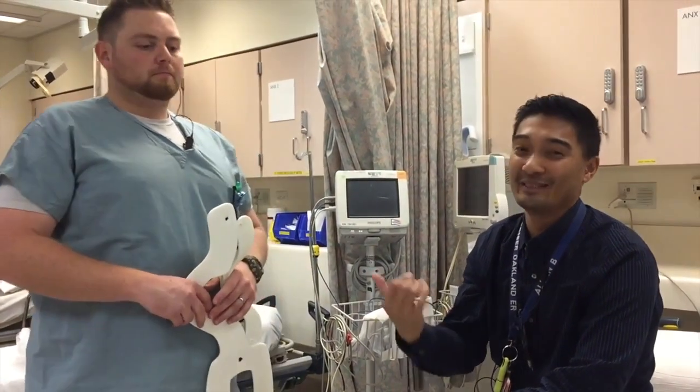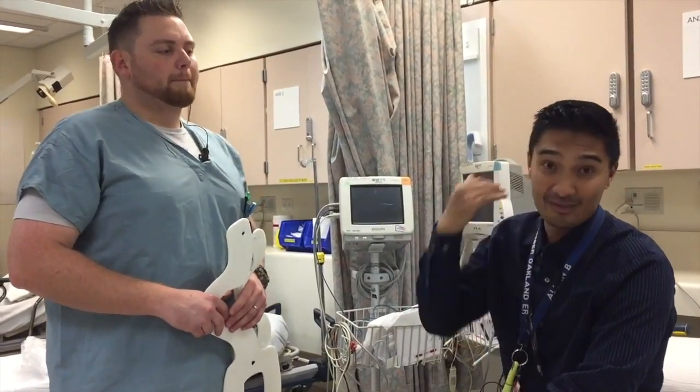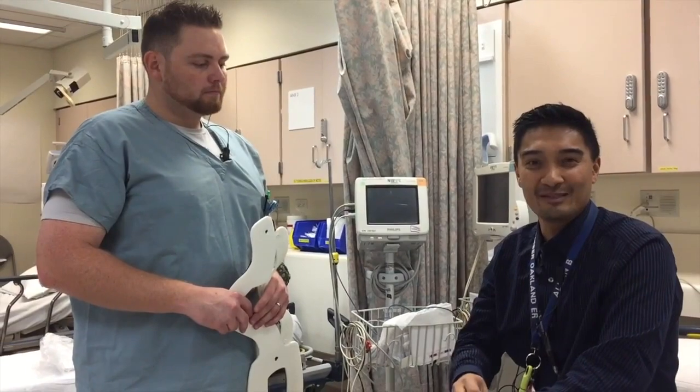There is an improper way, but Jake's going to show us how to properly do it — how to properly measure it and put it on a patient who has any issues with C-spine. Any issues with C-spine, make sure we take the correct precautions to put this thing on.